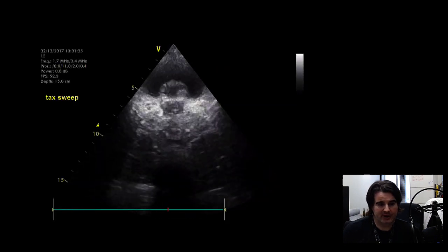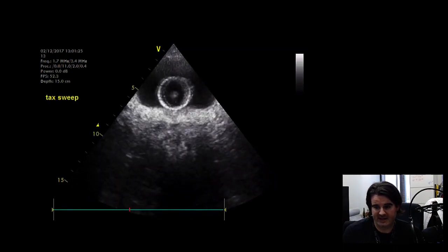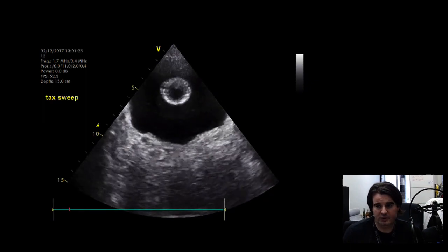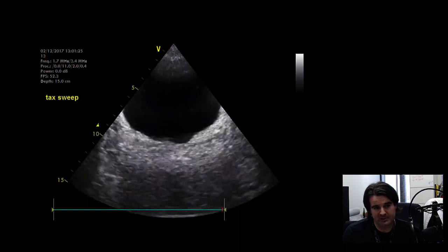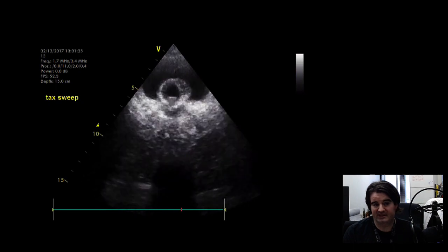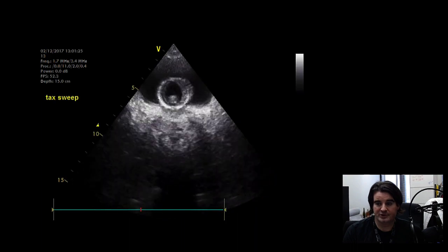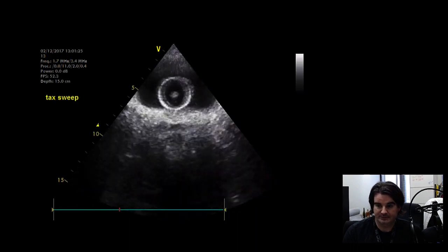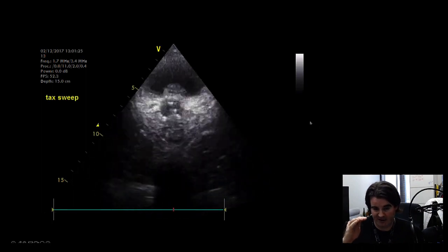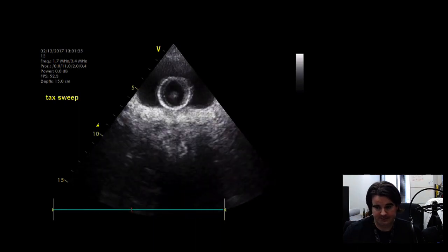Now looking at bladder ultrasound. Again, this is a really important part of performing this exam, looking at the kidneys. This patient here, interestingly enough, actually had renal failure in our ICU and was oliguric. And lo and behold, upon scanning for ascites, we discovered that the bladder was severely distended above this level. In fact, the bladder was partially obstructed here, so some urine was draining, but a lot of it was being held back. And to discover the Foley catheter, you do have to make sure you scan and fan the probe down below the pubic symphysis, because generally the Foley balloon will be fairly low.